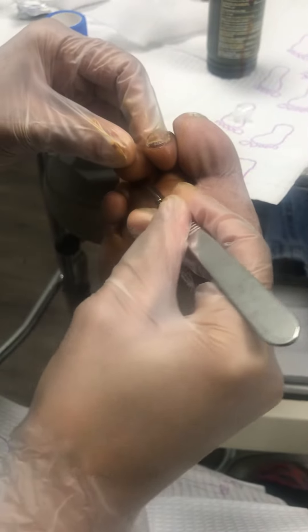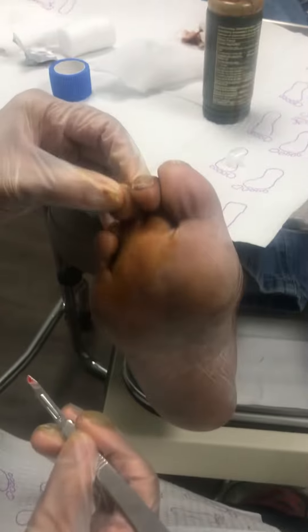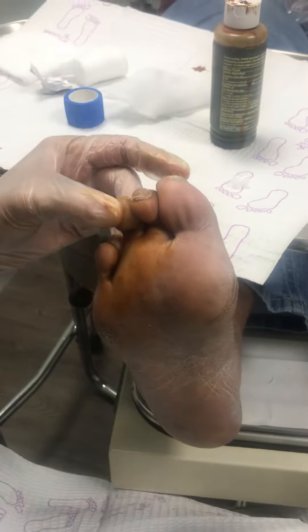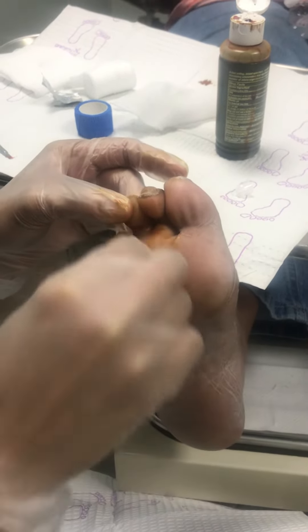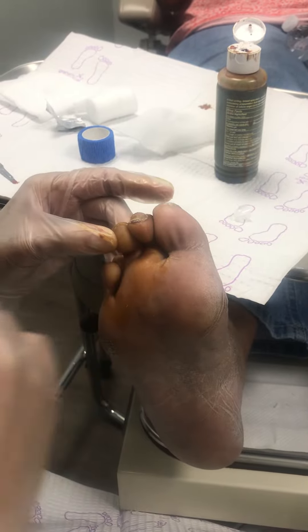And I just cut the tendon. You hear that? Like celery. And now it can straighten up a little bit more. Totally not getting rid of the contracture, but we got rid of most of the contracture and she's going to now walk more on the bottom than on the distal tip.